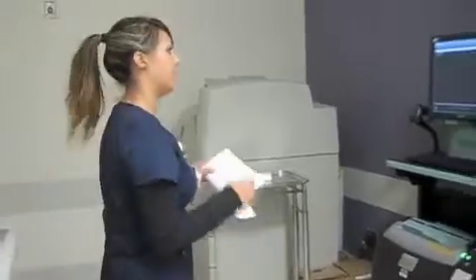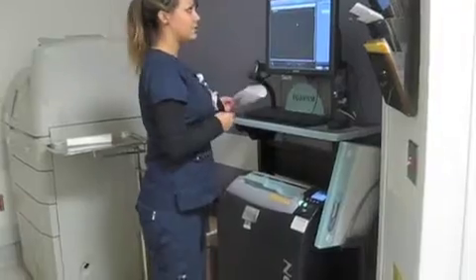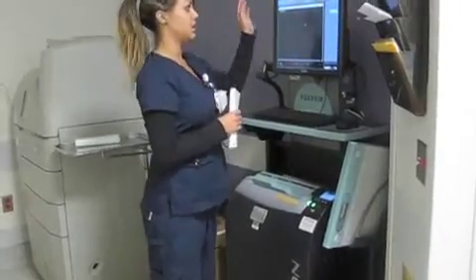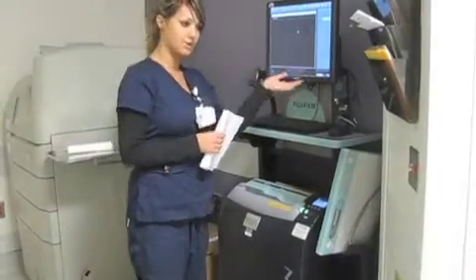So I got a rec for a 2-view chest. The first thing I'm going to do is take the rec and come over here and bring it up on our computer system. So I'm going to scan the rec and bring up the patient and make sure that on the menu is the views that I have, which would be a PA chest and a lateral chest.